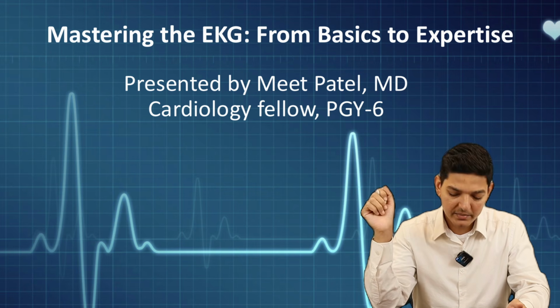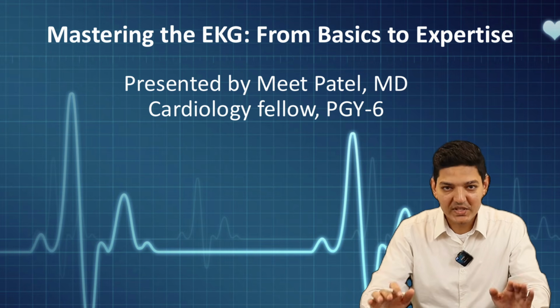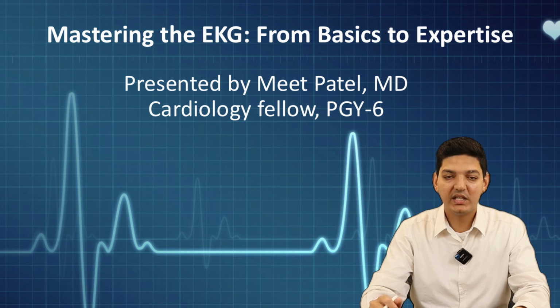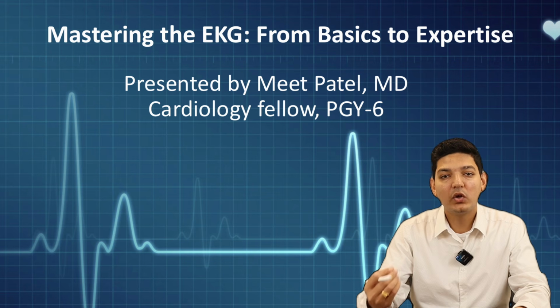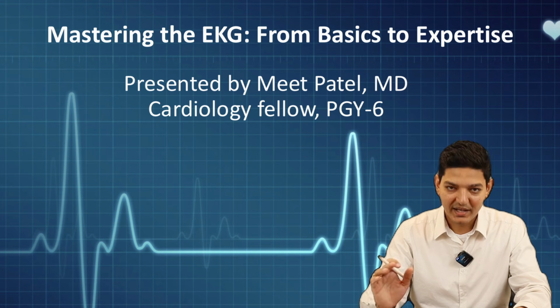All right? So it doesn't matter how much you have disliked EKGs in the past, I promise you this video will surely help you to read EKG in a much better way, and you will see a noticeable difference in the way you interpret EKGs. So without any delay, let's get started.